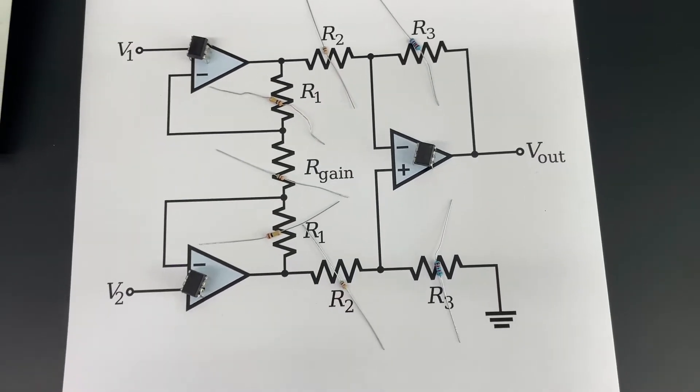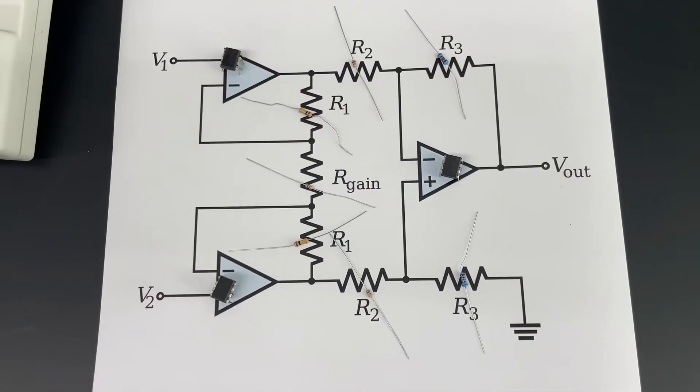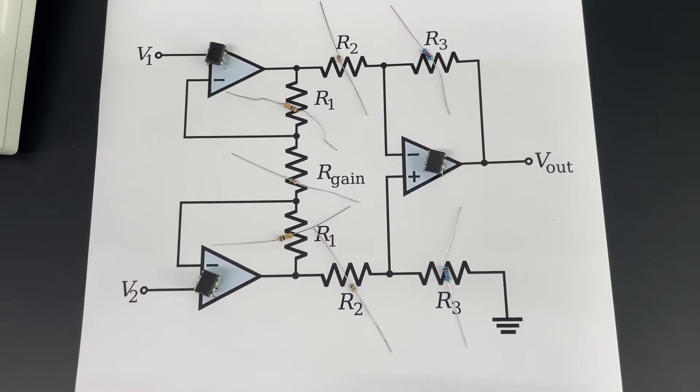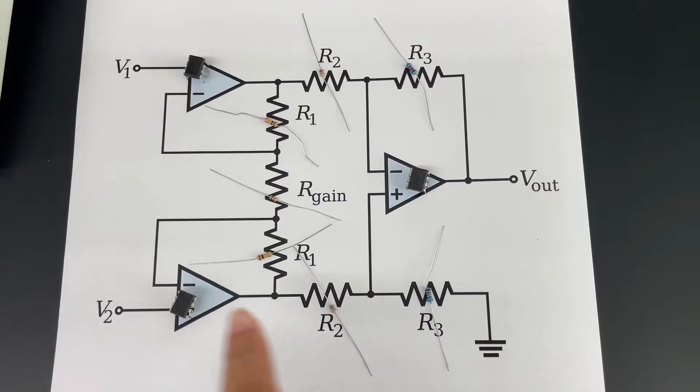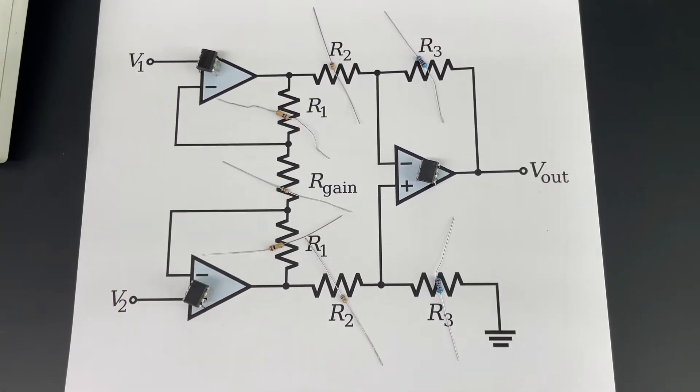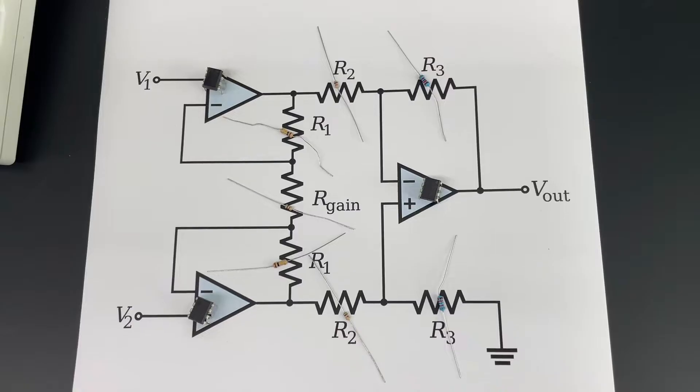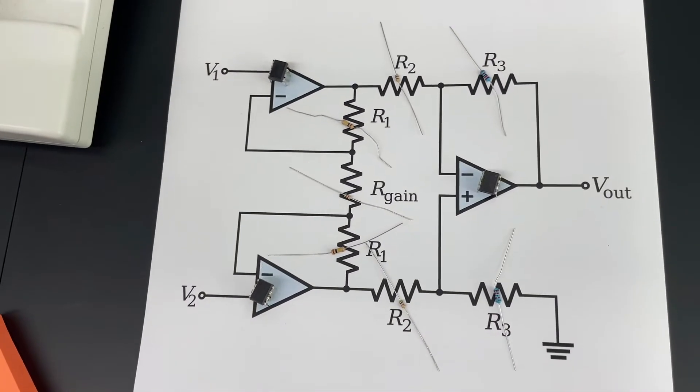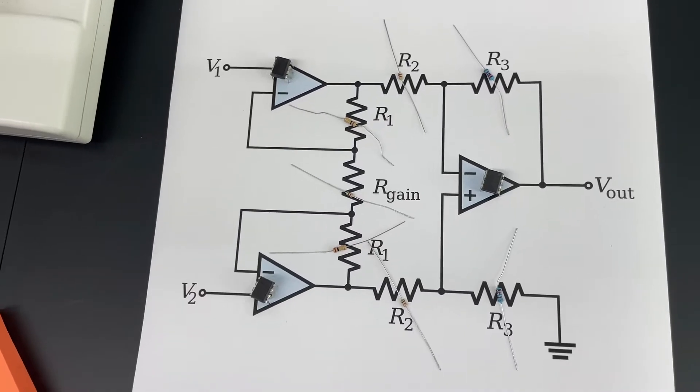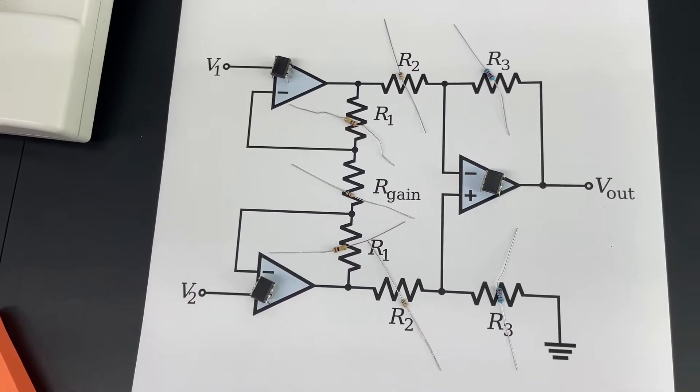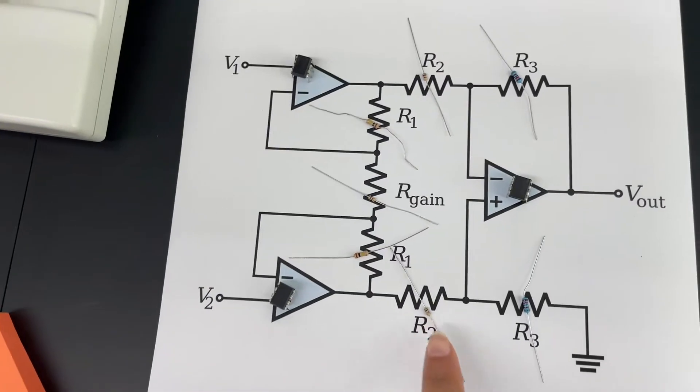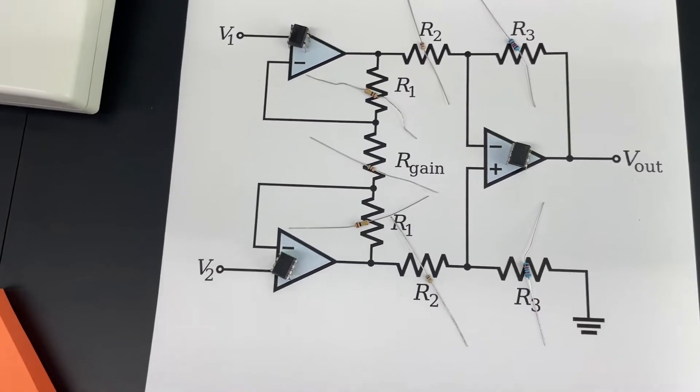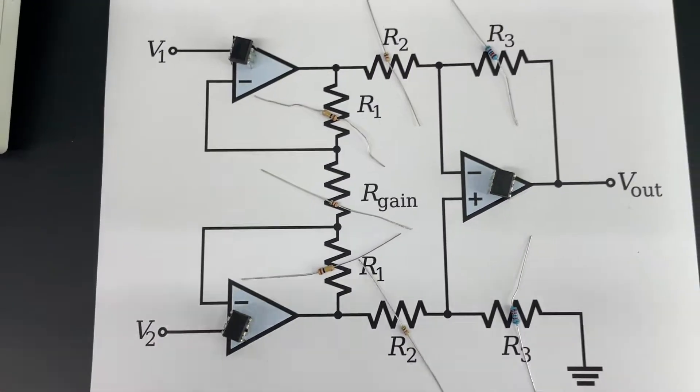In this video I'm going to implement this instrumentation amplifier and look at my ECG signal. As you can see I prepared the resistors for this design. I picked my R3 to be 82k, my Rgain is 5k, my R2 is 5.1k, and R1 is 100k.